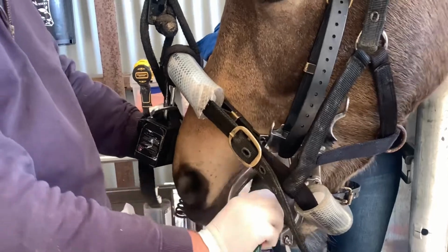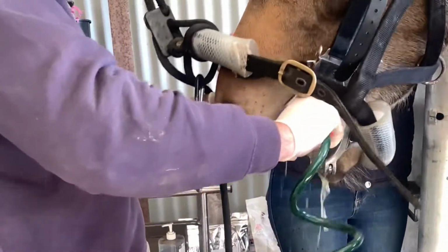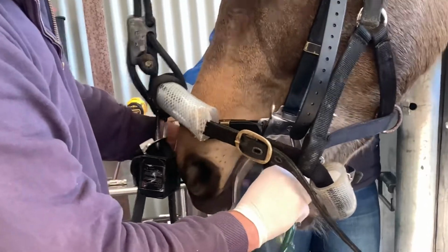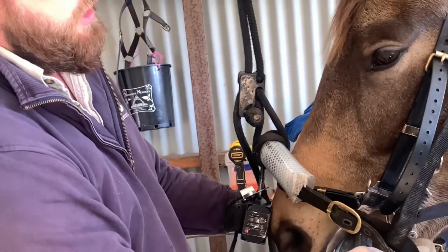Sometimes in really bad cases as well, you'll see a horse, you'll get a big wad of food drop out now. And that'll often be if they're packing food around. You spray your nurse with the water just to keep everyone awake. And this is sometimes too where you'll get a bit of smell, you might get a bit of discharge, you might start to notice some periodontal disease has a very distinctive smell.